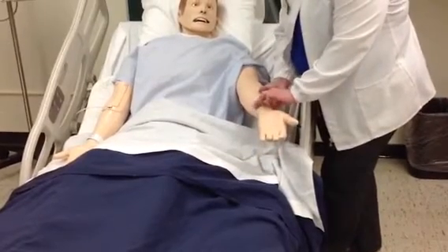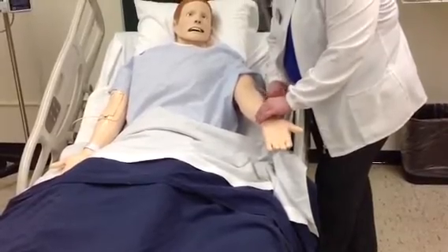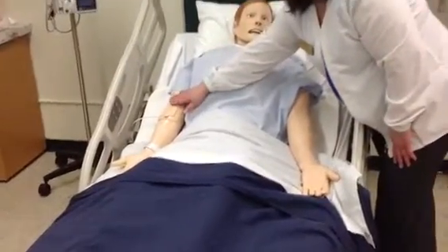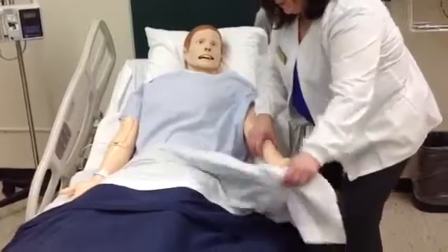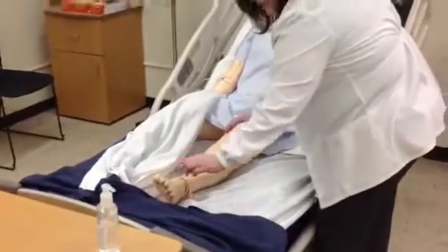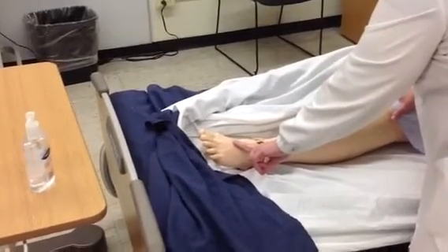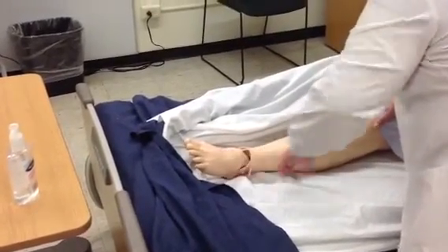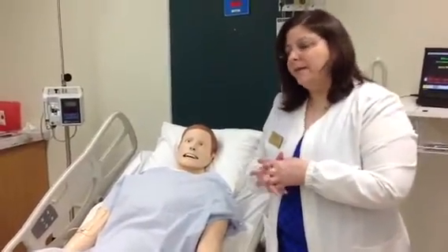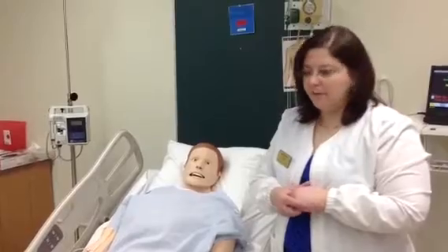He has radial pulses, which are a little higher than you might expect them to be for him. He also has brachial pulses, although not a brachial pulse on this arm because this is where his IV is. If we pull the covers down, you would be able to find pedal pulses. And those pulses can be bounding, they can be weak, they can be greater on one side than the other, and that's all programmed by your simulation instructor in a computer behind the two-way mirror.